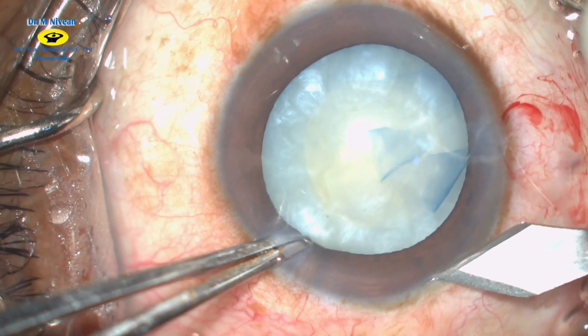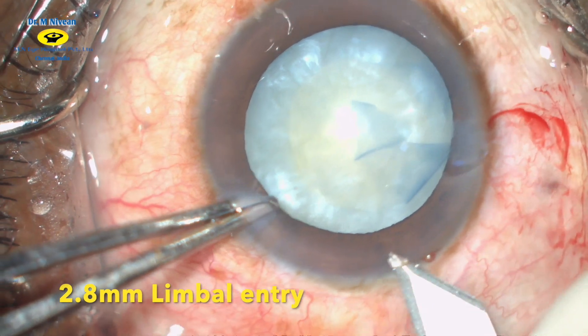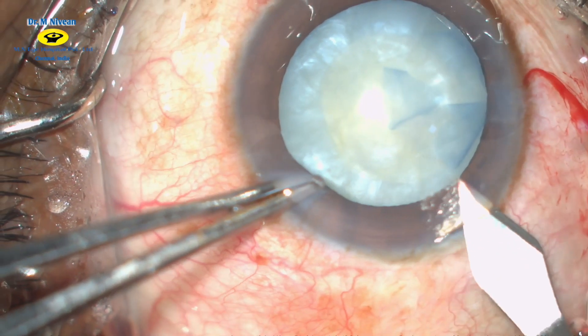A groove is made at the limbus and using a 2.8 keratome, a clear corneal incision is made. This is useful in case conversion is required.